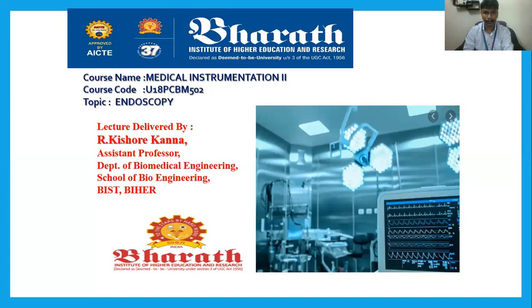Endoscopy is a methodology used to view the internal structure of the human body without any cutting or coagulation process, or any surgical procedure. It has been widely used for viewing the internal architecture and physiology of the human body, which is not visible unless an invasive methodology is carried out.